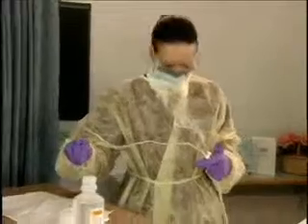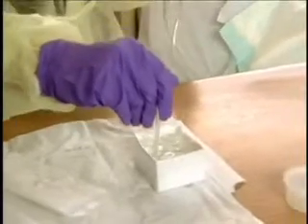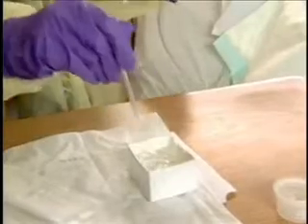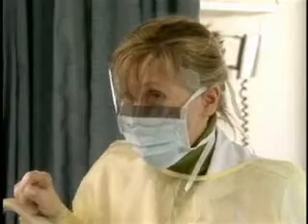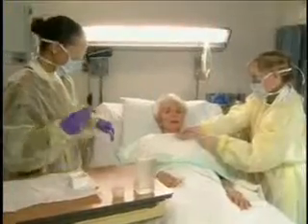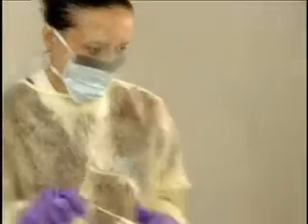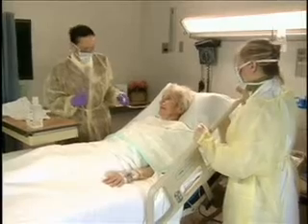Now I insert the catheter in the sterile saline solution to flush it. Very good. Repeat the suctioning procedure as needed to clear the secretions, allowing at least 20 to 30-second intervals between suctioning attempts. Okay, Mrs. Marconi, can you cough for me? All right. Take some deep breaths. Good.